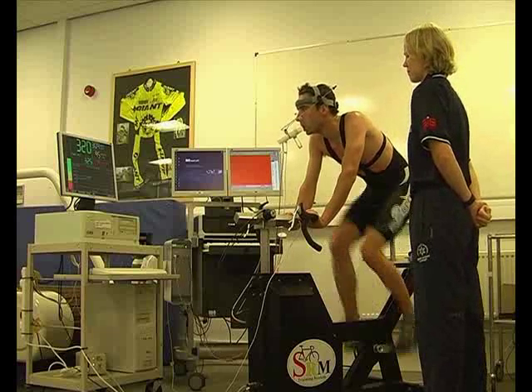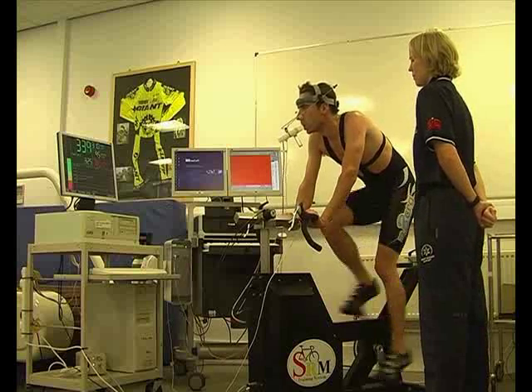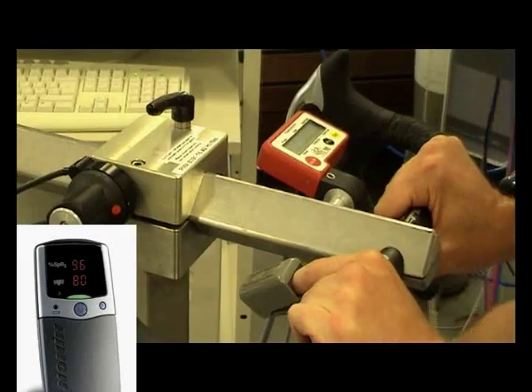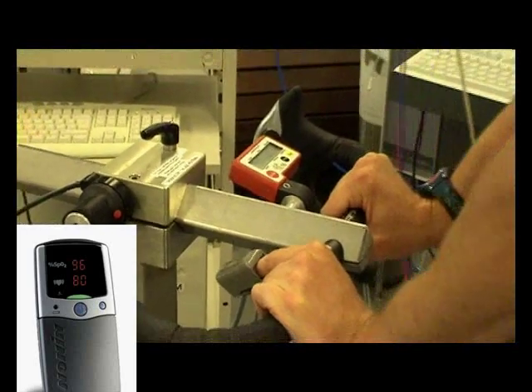One of the determinants of how much oxygen we can consume in a minute is how much oxygen we can carry in the blood. And this is how we measure that — see the pulse oximeter on the index finger?